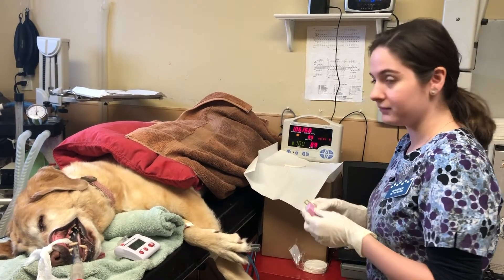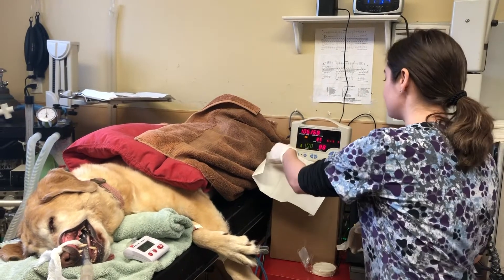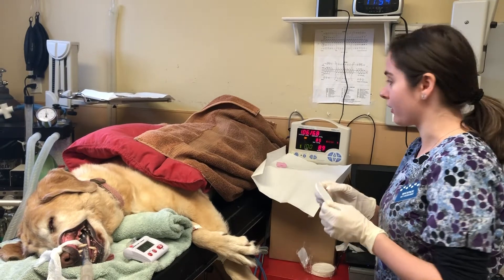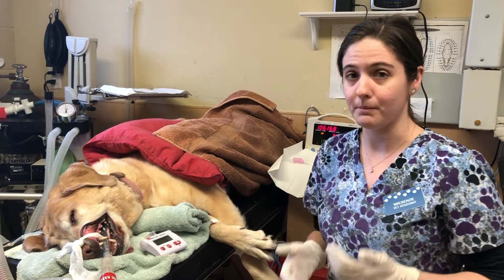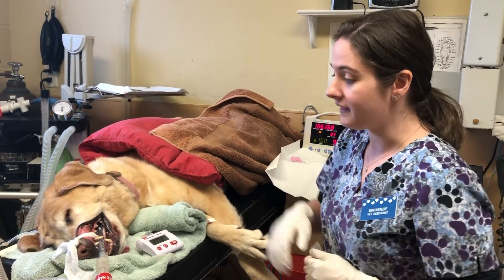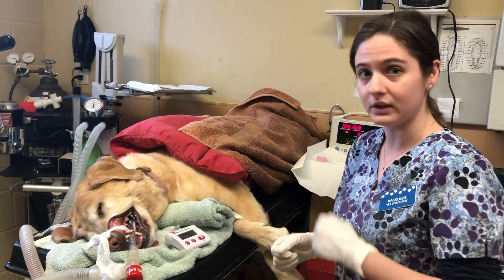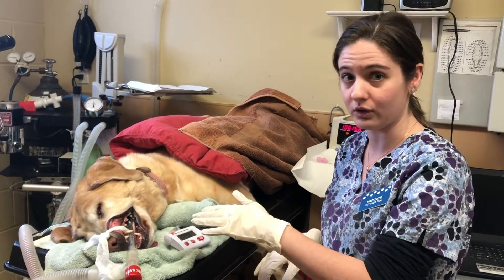I have my lancet that I'm going to be using to make the incision. I have my filter paper that I'm going to be using to blot the blood away. And then I have my stopwatch, which I'm going to be using to measure the amount of time it takes the blood to clot, which is called bleeding time. And then I also have my gauze strip, which I have already used to tie back the lip so that I can expose the buccal mucosal surface.